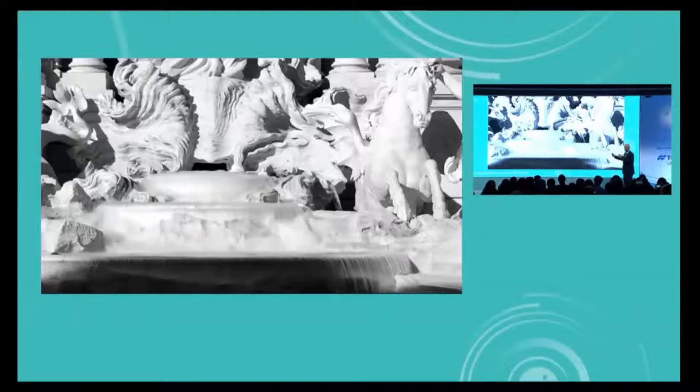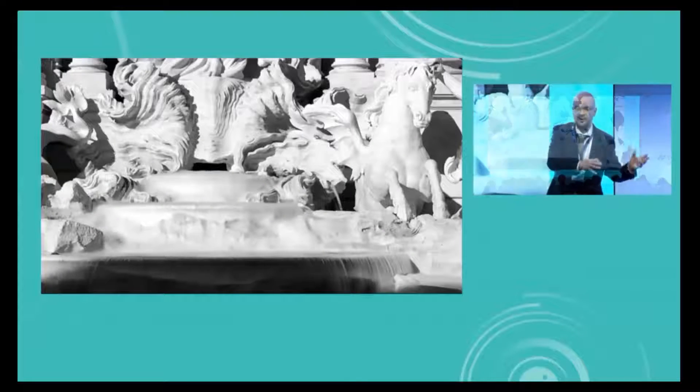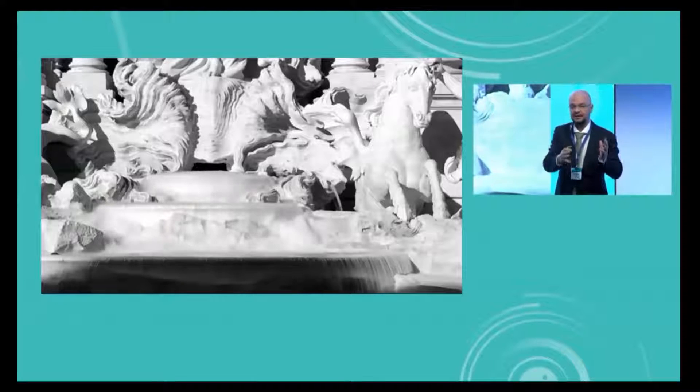What I wanted to do was create an OCT angiography of the Trevi Fountain. You take the footage, copy it, remove one frame, and then subtract one from the other — that's how you get an OCT angiography. And this is what comes out: an OCT angiography of the Trevi Fountain, with larger vessels and smaller vessels. When you summate all of that, you get exactly what we have in an OCT angiography.